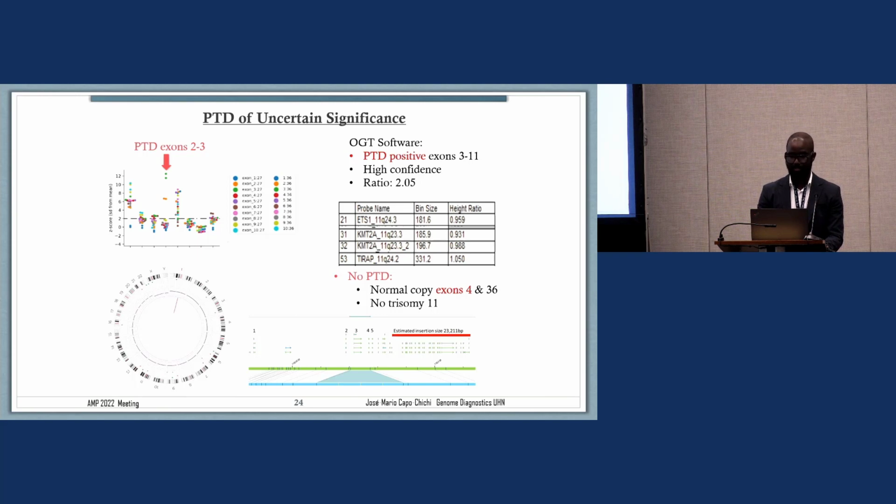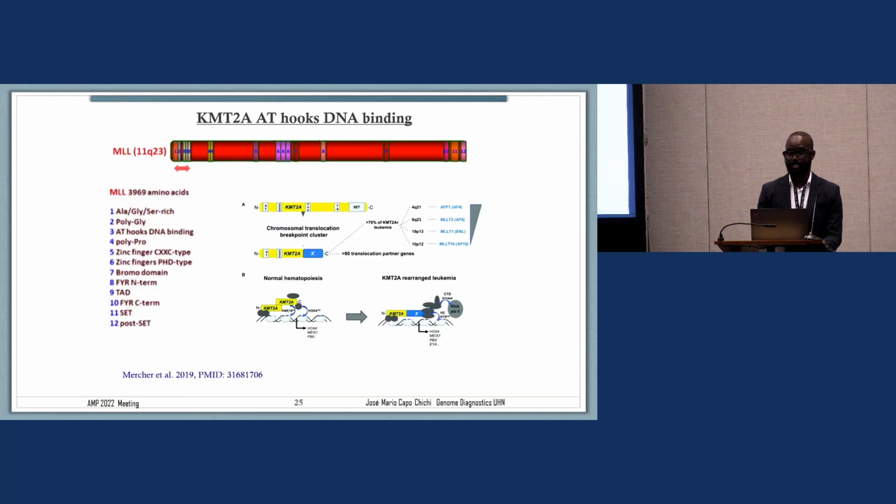Just highlighting that the PTD observed in this particular patient is smaller than typically seen in the canonical PTD involving exon 2 to 10, which is also compatible with a smaller PTD in this particular patient. Now, is this PTD oncogenic? This is what we're looking at the moment.